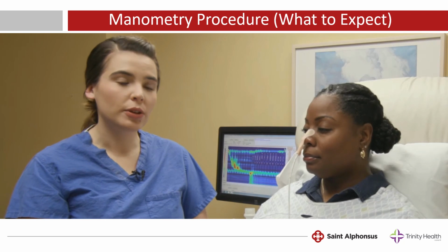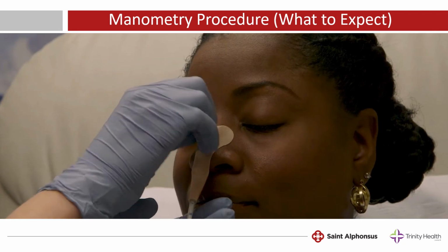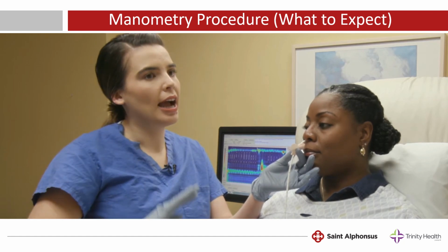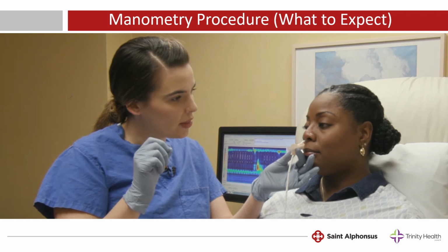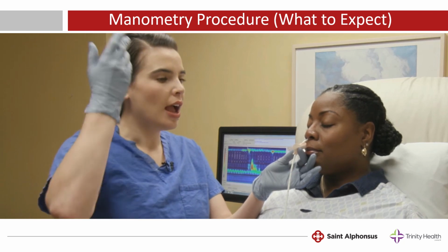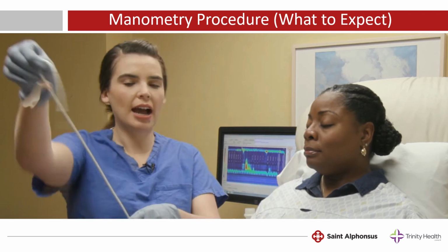So now we are all done with the procedure. I'm going to instruct the patient about removing the catheter. So I'm going to take the tape off. What I'm going to instruct you to do is to take a deep breath in and out, and another deep breath in. And on your second deep breath in, as you hold your breath, I'm going to remove the catheter. So go ahead and take a deep breath in and release it out. Good. Another deep breath in and hold it and out.